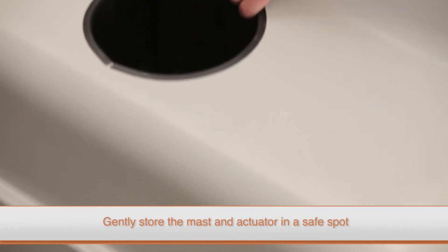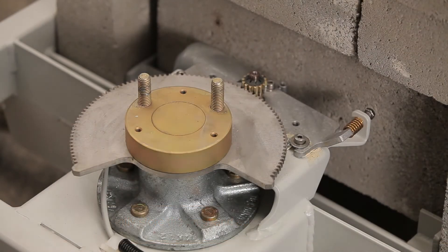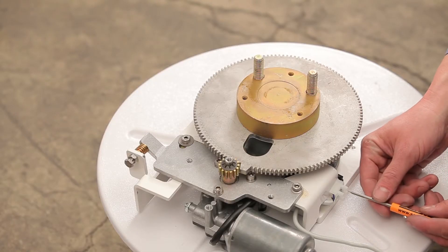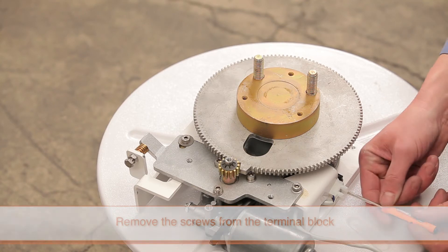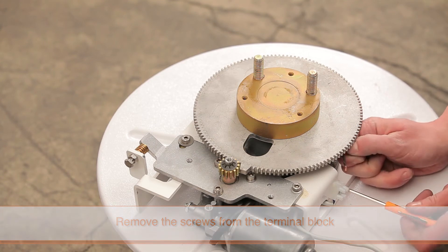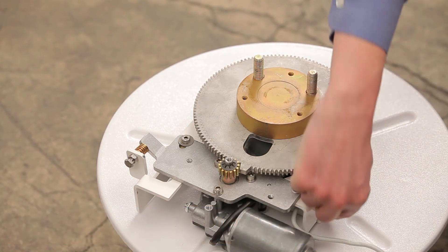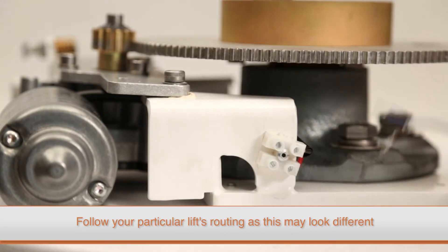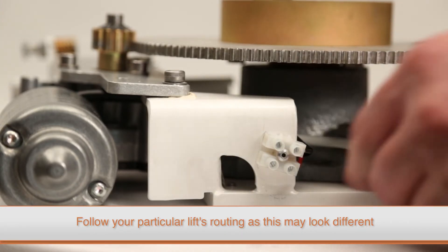Finally, remove the lift cover. To replace the motor cable, loosen the two screws in the terminal block with a small flat blade screwdriver, then remove the cable end. Make sure to note the cable routing, as this will need to be repeated when installing the new cable.